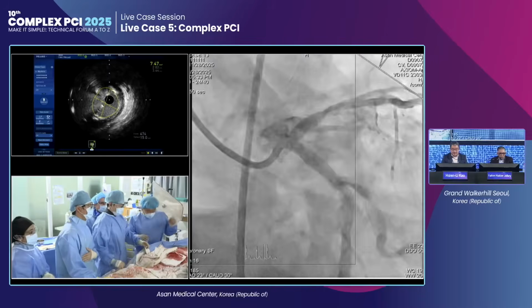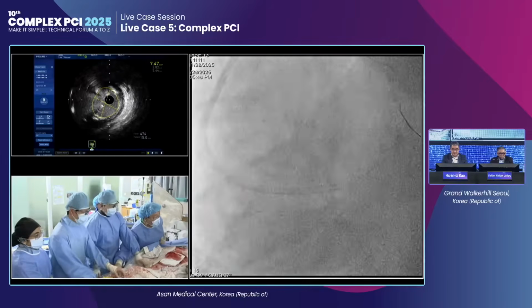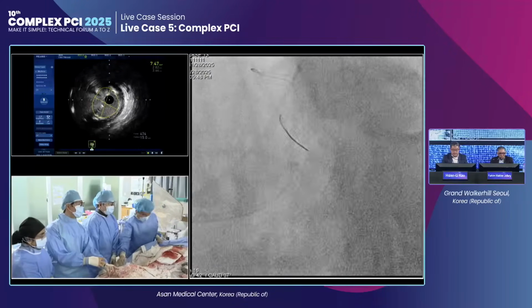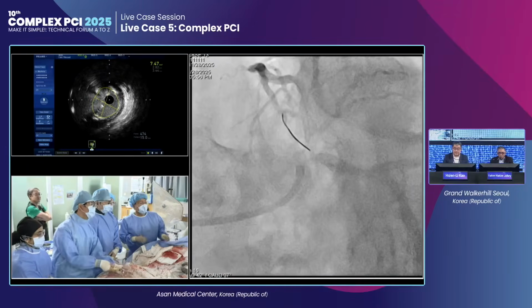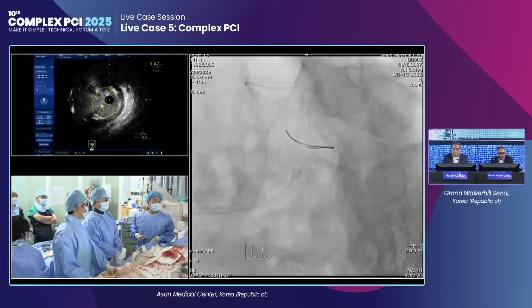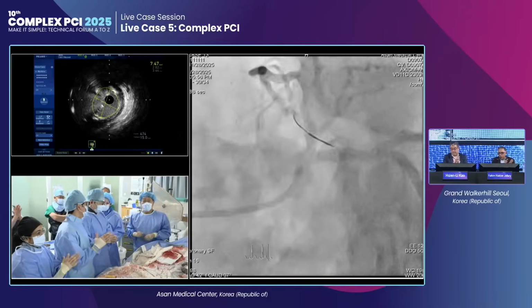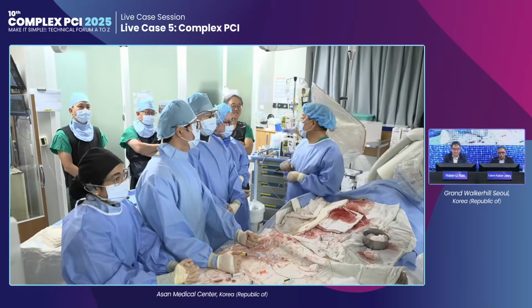All right, we're gonna show the last spot. I think it's quite nice, okay. It's not even 95, 96. Very educational. Thank you.